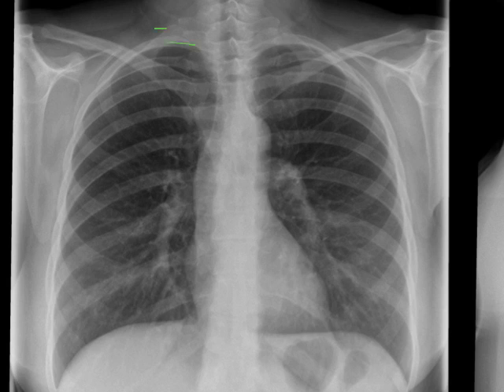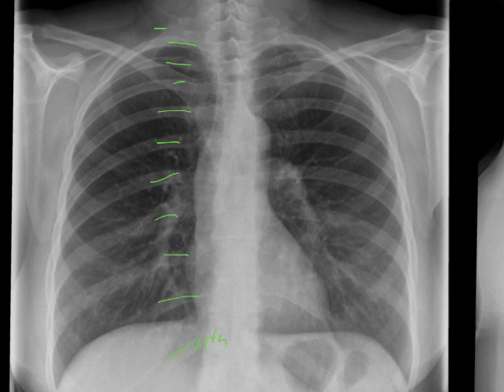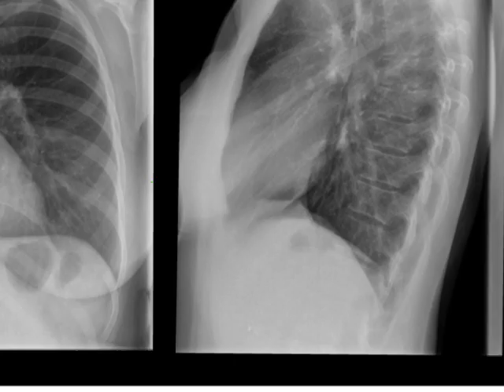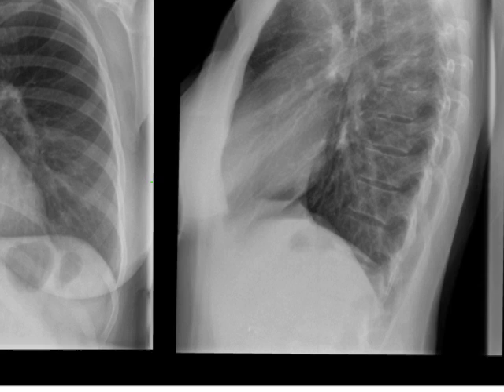In a normal degree of inflation, the hemidiaphragm is down to approximately the tenth to eleventh posterior rib. On the lateral study, this is shown as a nice degree of diaphragmatic curvature. If we draw a line between the anterior and the posterior costophrenic angles, we should see at least three centimetres of curvature between that line and the top of the hemidiaphragm in a normally inflated lung.